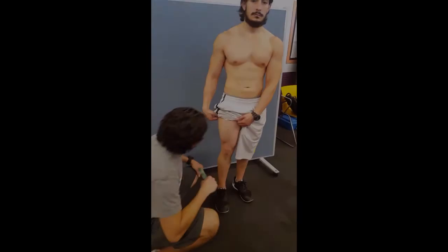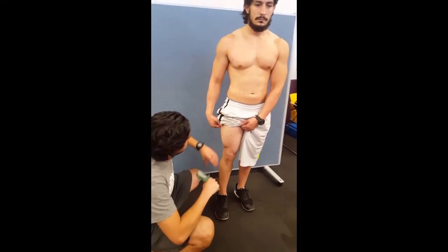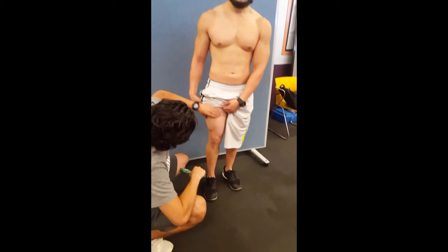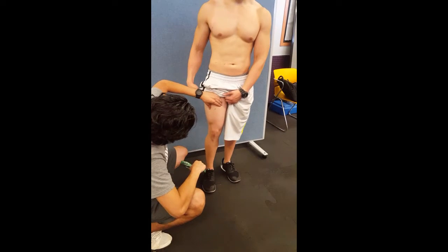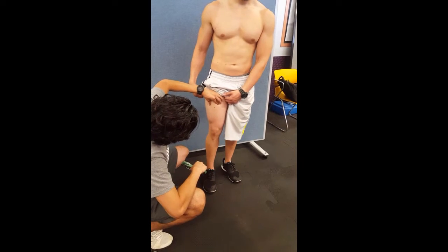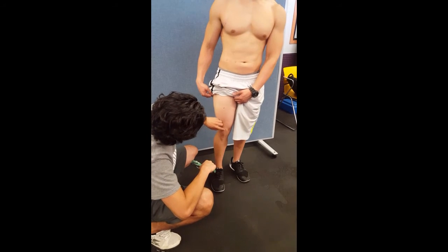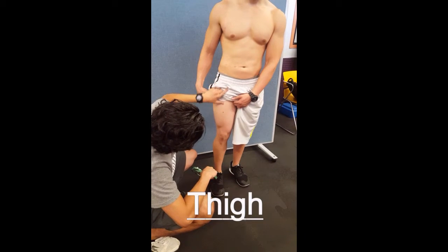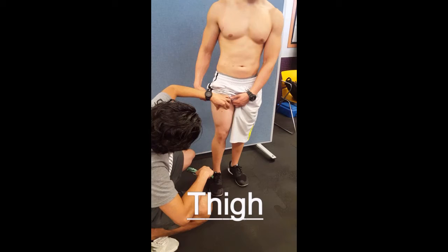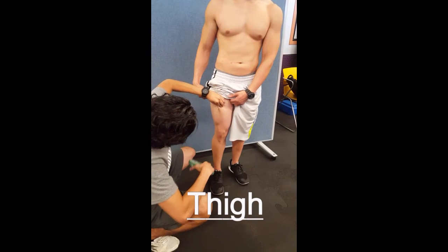Last but not least, we have the thigh. It is a vertical fold on the anterior midline of the thigh, midway between the proximal border of the patella and the inguinal crease, or the hip. You want to shake off all muscle, and just go ahead and grab skin and fat.